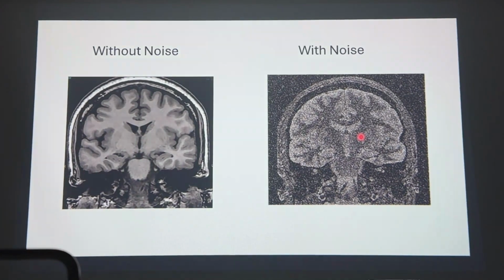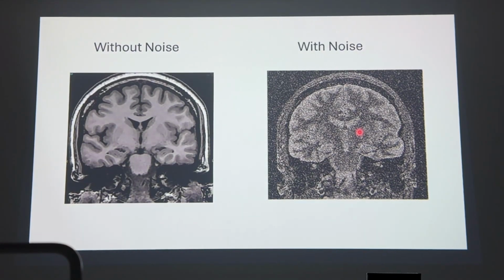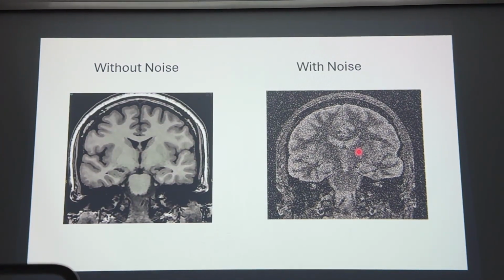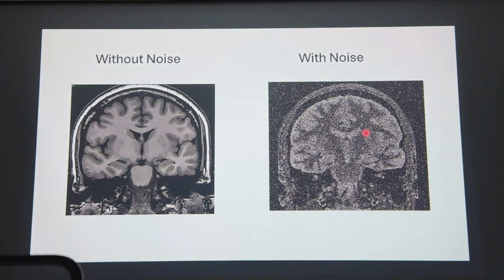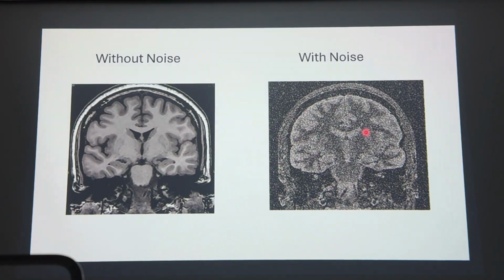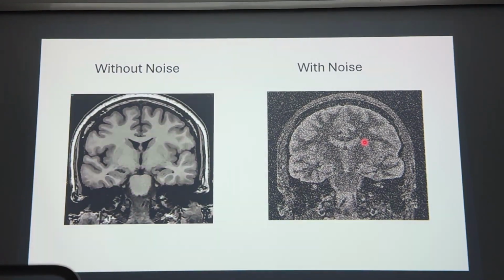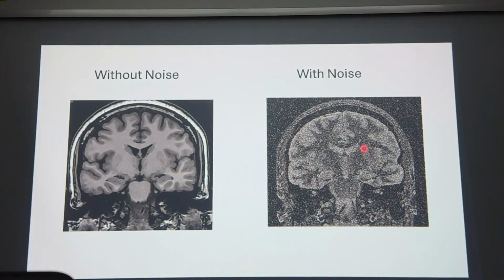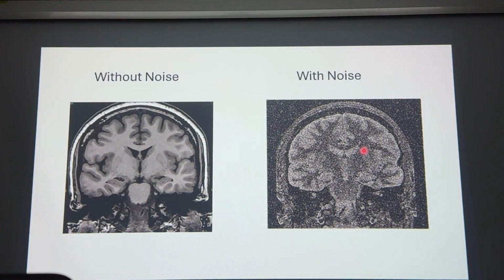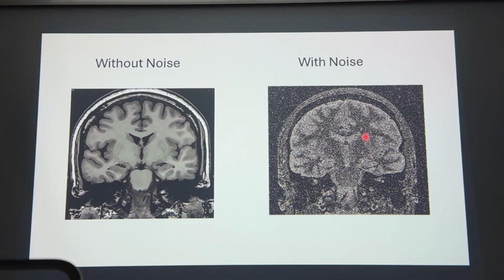We can raise the question about the source of noise. The answer is this random RF energy can be generated by thermal activity within the electrical conductors and circuit components of the receiving system. And by the way, the patient body is the largest RF receiving system, and so is the largest source of noise in the MRI image. Other devices in the environment include coils, data cables, fluorescent lights, and computing equipment, which contribute to this random RF energy emitted power, which interferes with the MRI signal.